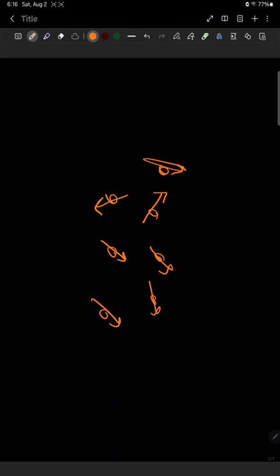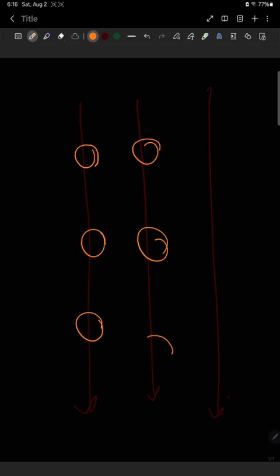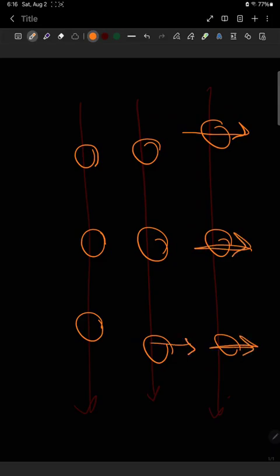Now what happens when I apply the external magnet, the strong magnet that is usually about 1 to 3 Tesla? Those hydrogen atoms will align with the external magnet. They will be in one direction.